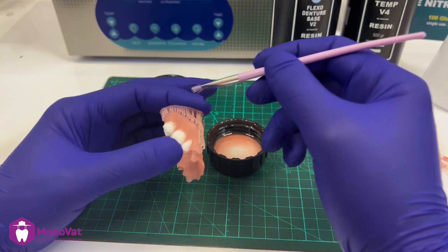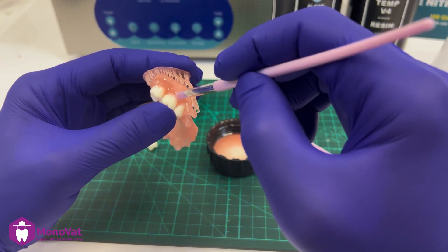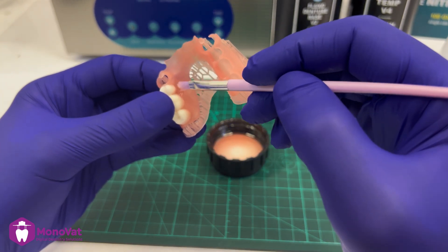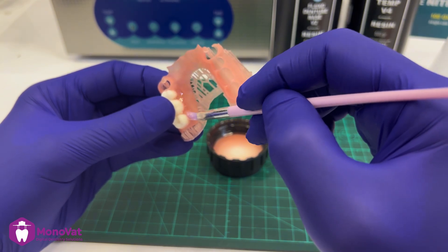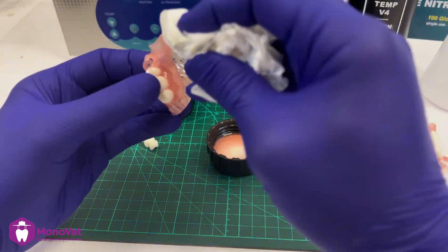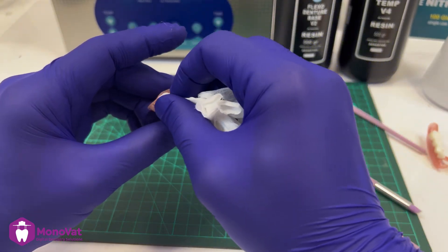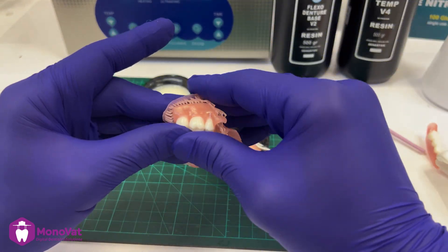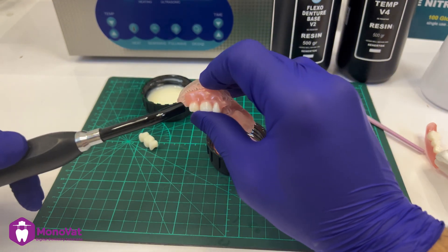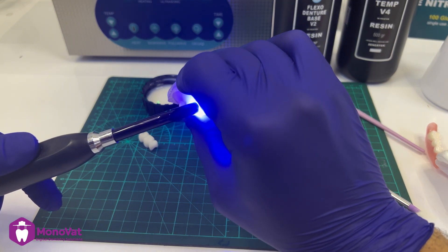Fill the gap between the teeth and the denture using a soft brush, then clean the extra resin using a tissue. Cure it using a handheld cure light, holding it for 15 to 20 seconds on each area to ensure that the tooth is sticking well with the denture.